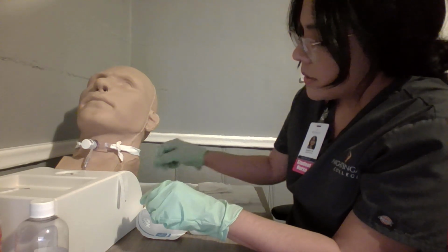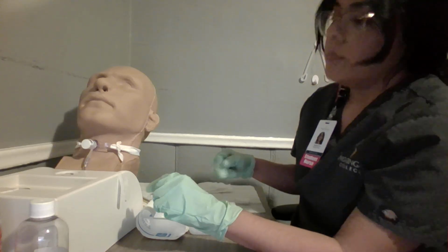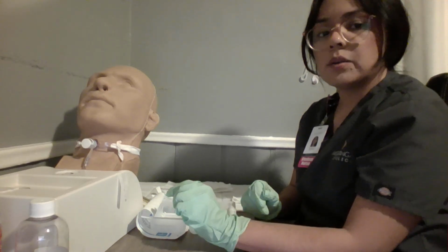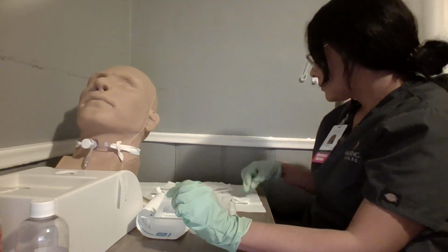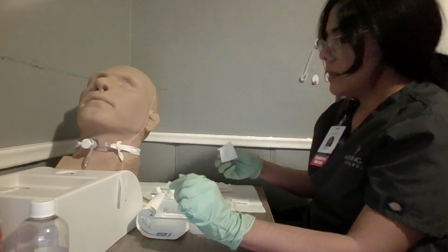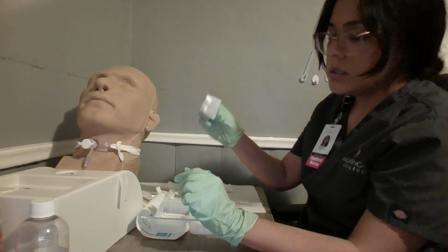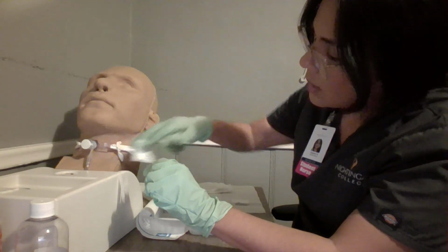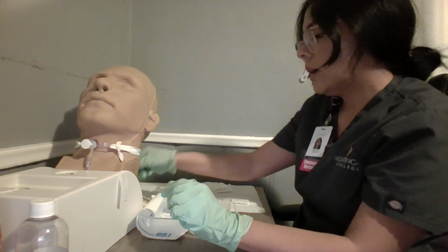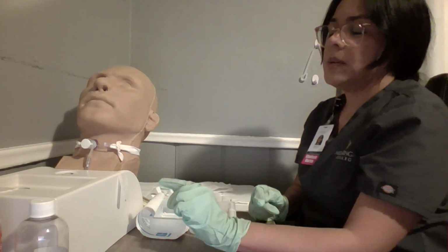I will use sterile normal saline again to remove any crusty secretions. I will then thoroughly dry my patient's skin and the flanges using a dry gauze square. I will discard this.